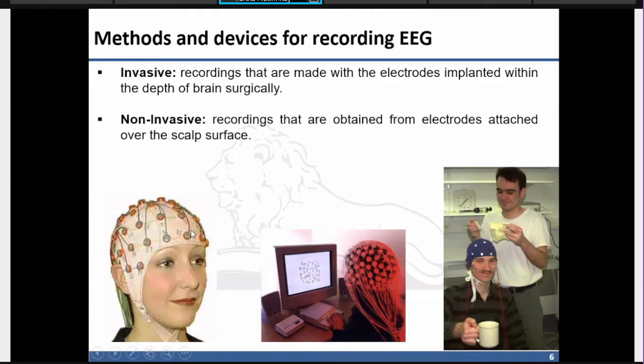When you do some activities, this will record the signals of the brain, similar to your fMRI image. And from those signals, doctors or medical experts understand what the disease is and what the severity of the disease is. Now there are several kinds of these recording devices. So these kinds of devices, there are many.